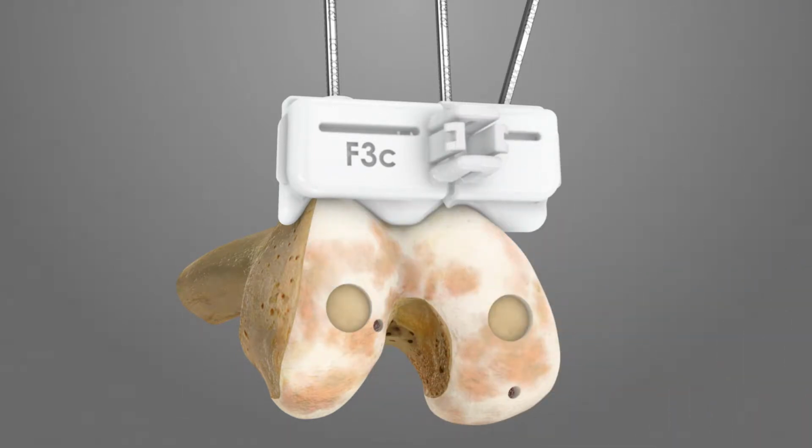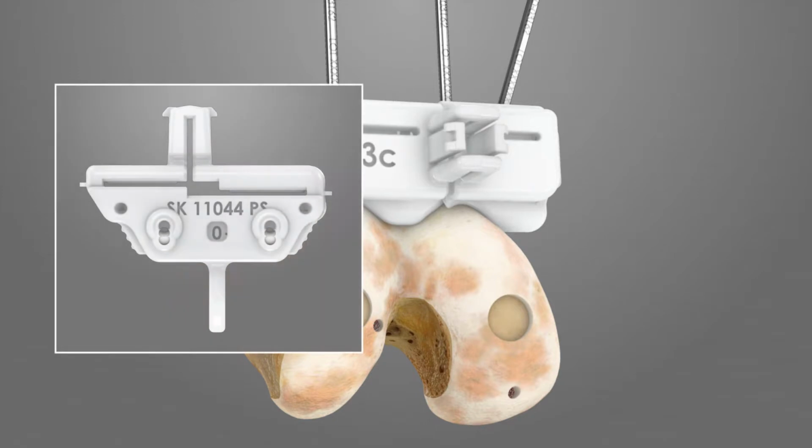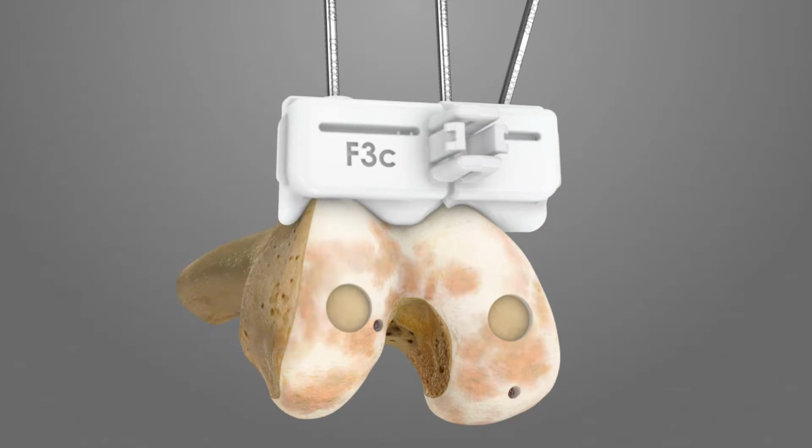If an additional 2mm of bone needs to be resected from the distal femur, slide the key so that +2 is visible in the viewing window before making the distal resection. If a more conservative distal femoral cut is desired, slide the key so that the -2 is visible in the viewing window before making the distal resection.